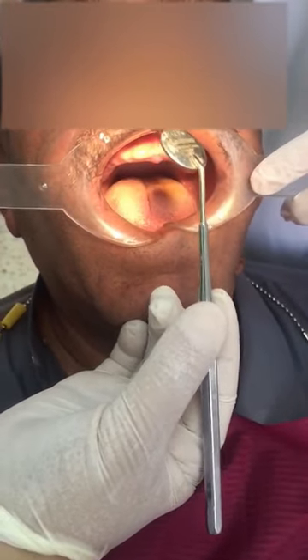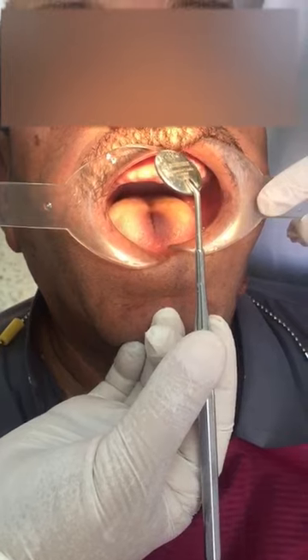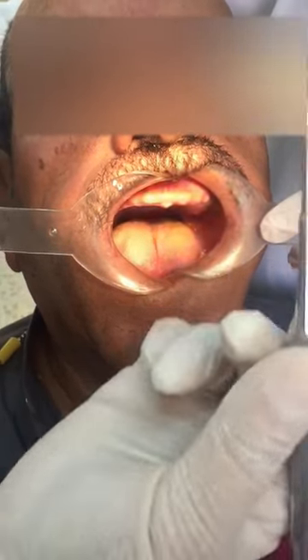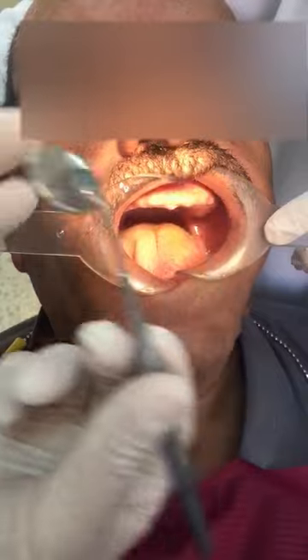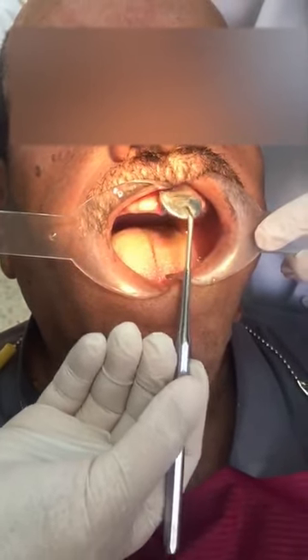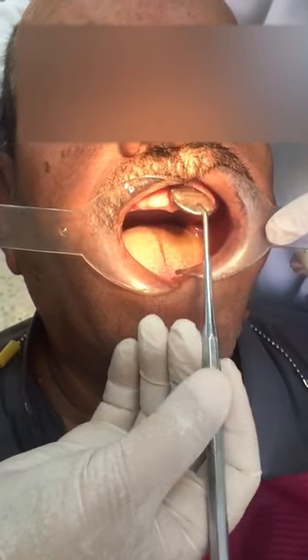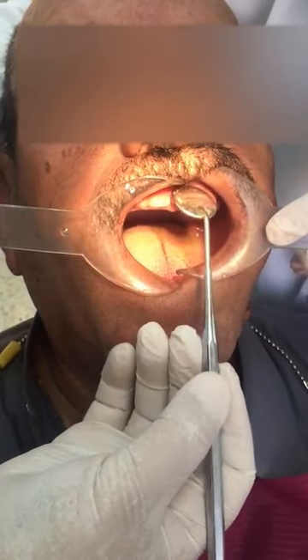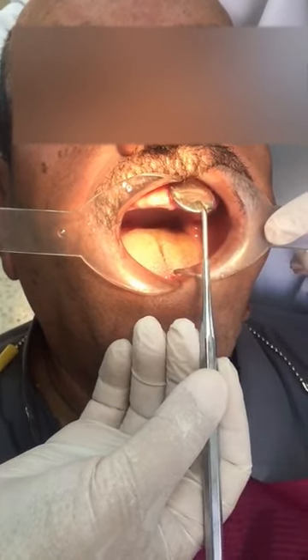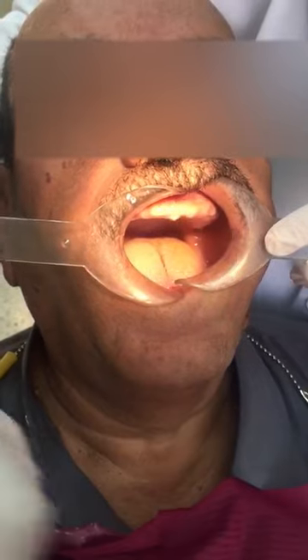Now the next question: we knew the origin of the undercuts, where they come from. Now we need to know — are they shallow or deep undercuts? If I am going to use this mirror, I'm going to create a path of withdrawal and just compare the tissue. If this is prevented and I feel that there is a shelf and it goes in there, that means this is a deep undercut — and yes, your question was valid: this patient has deep undercuts.